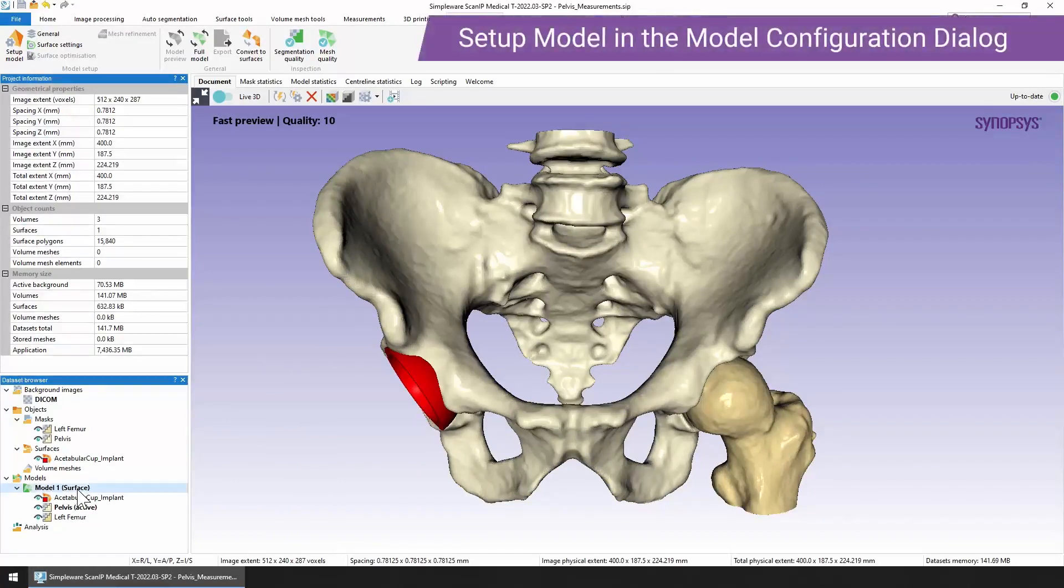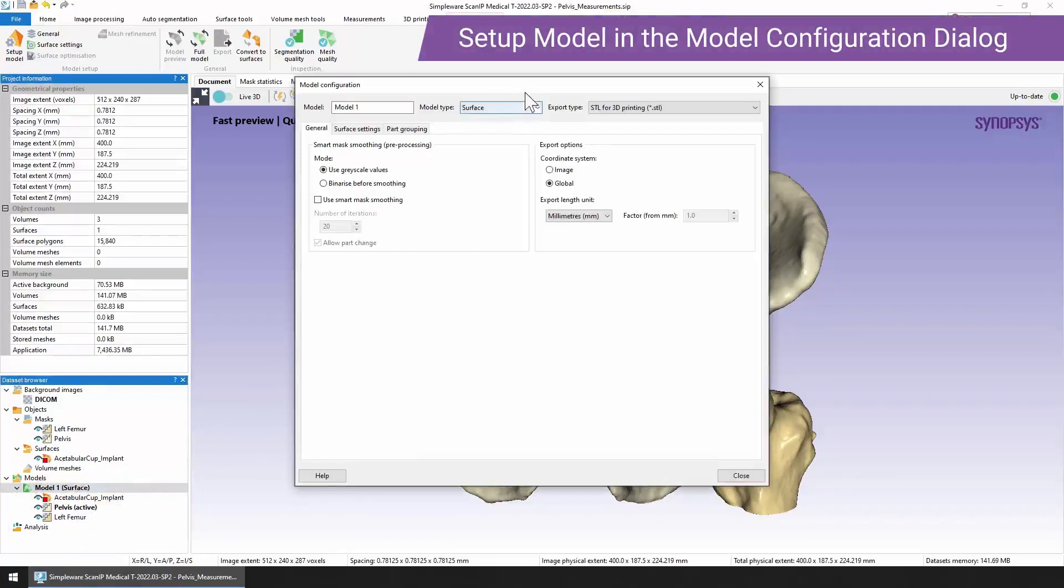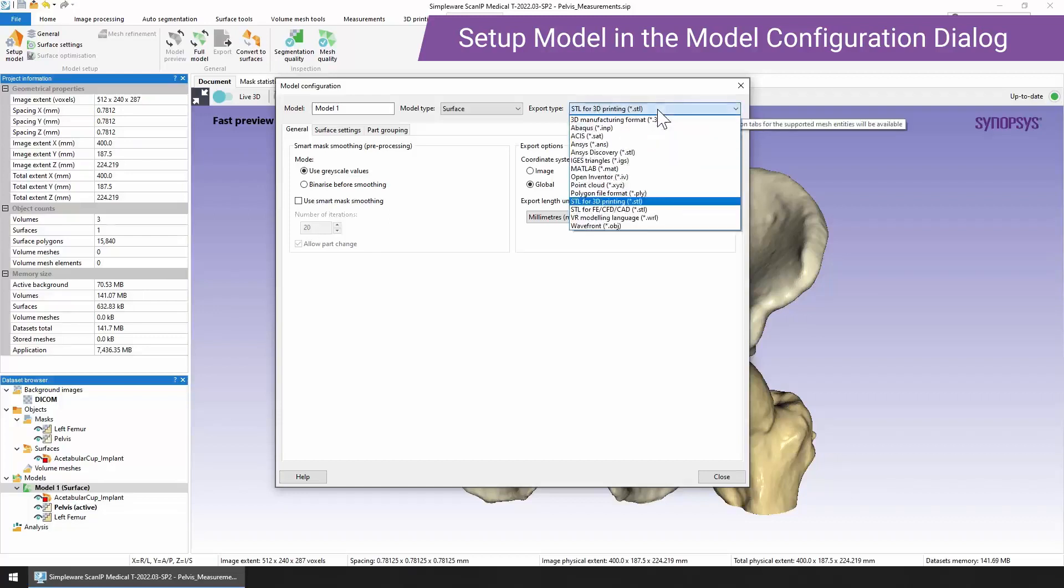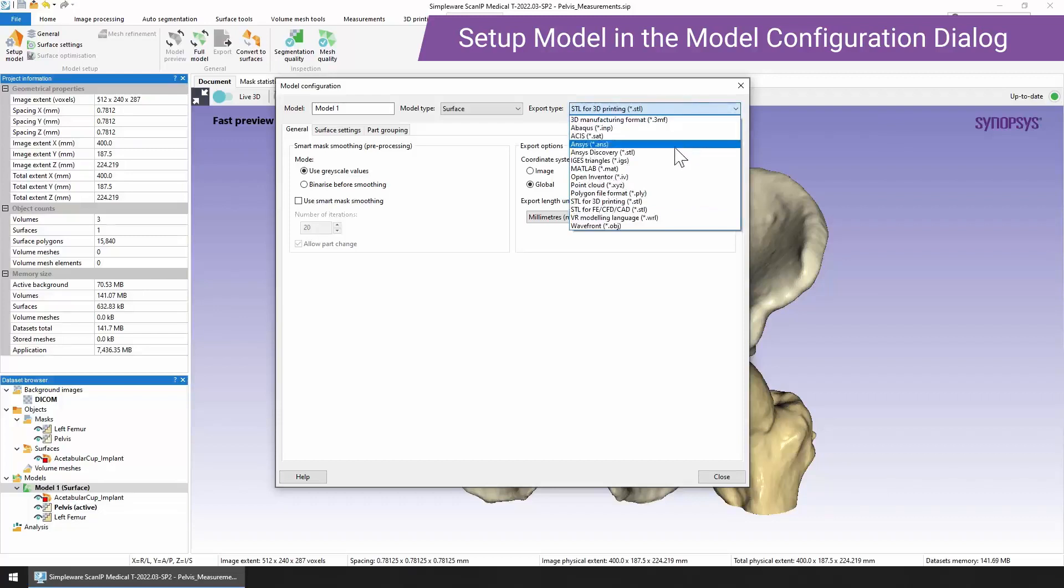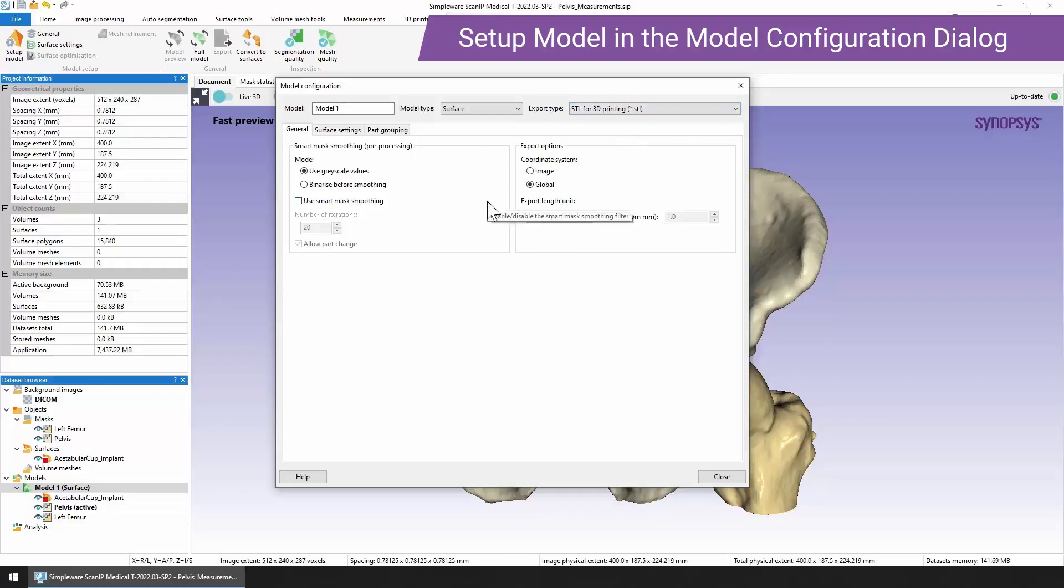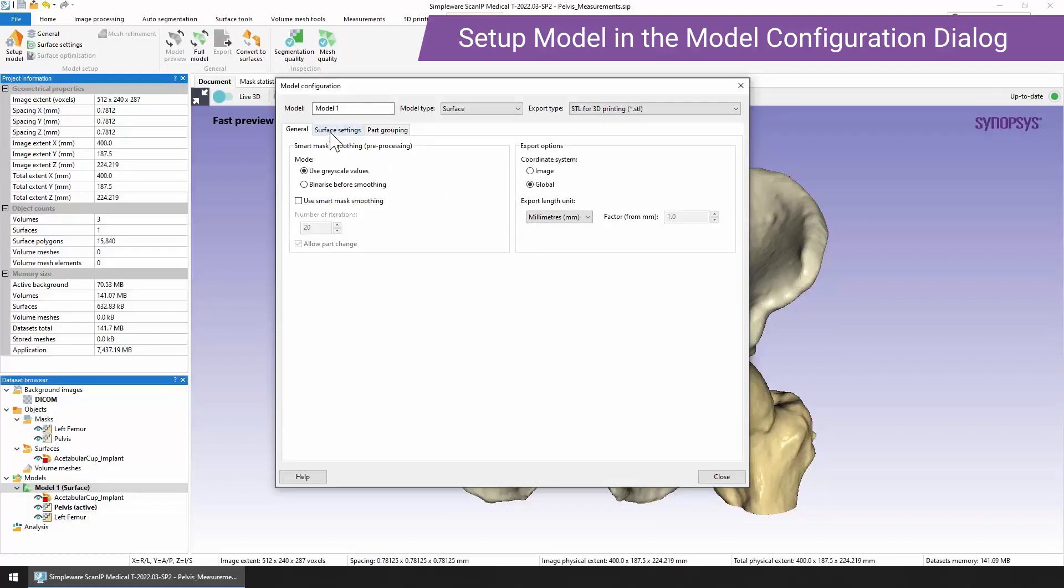If we right mouse click we'll get to the model configuration. This is really where we can set up all parts of the model. First thing to do is choose our export type. We have a whole different range of export types from 3MF to SAT. STL is one of the most commonly used. We have two different STL options which I'm going to look at today. The first is STL for 3D printing. This is a very quick setup so you just get a few options: some smart mask smoothing, which allows you to smooth multiple parts in one operation. I would stick with the default options in the first instance and then change them if you need to. And just quick export options for the coordinate system and the export length.